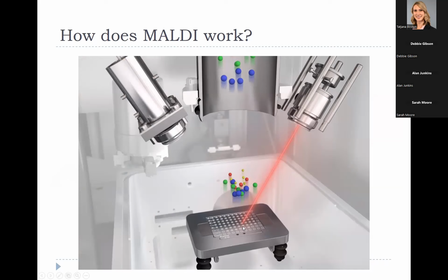And it's really pretty cool when you're watching it because it does like 40 shots in about half a second. And then it keeps doing that until it's got a good reading here. But you can see it blows the cell apart. Here are all these proteins, different size, different shape proteins.